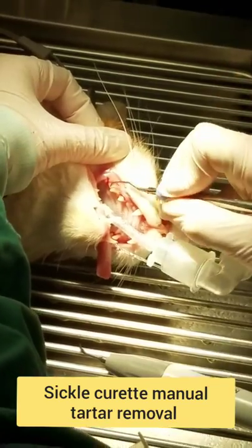I used this to take off the tartar. You can see that happening. So, I'm gonna switch right over here.